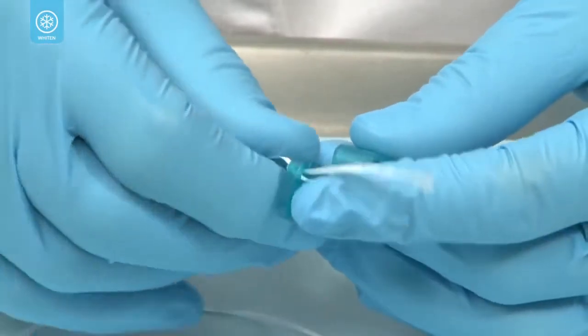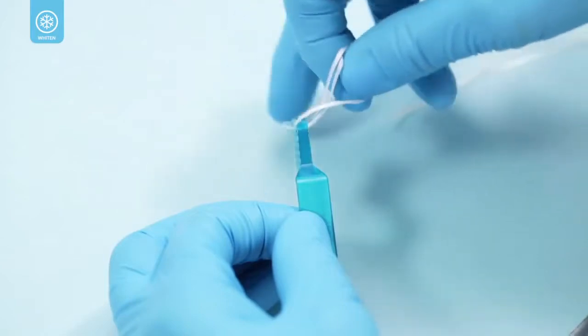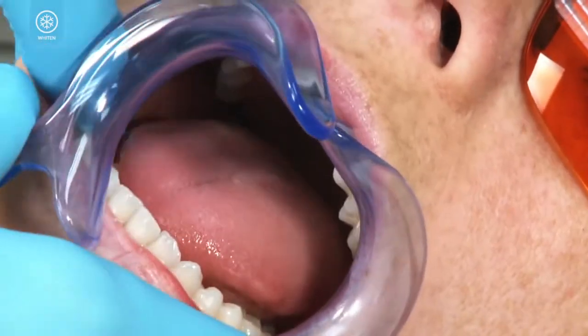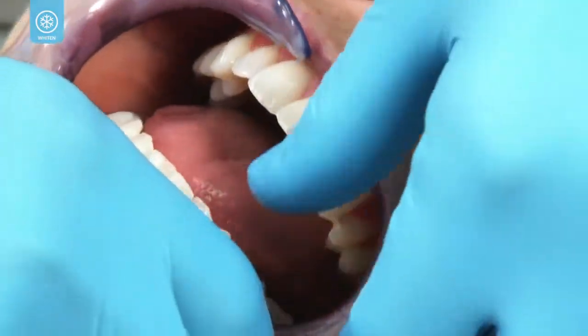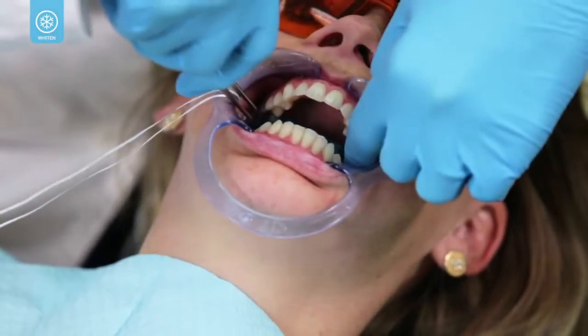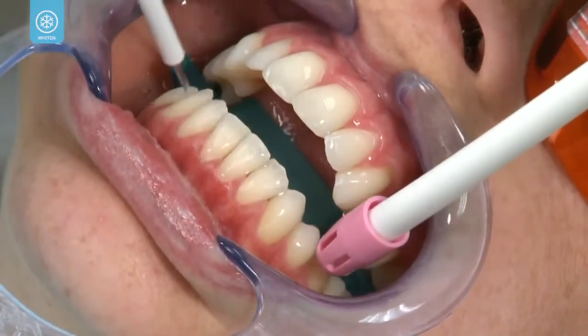For added security, tie a length of dental floss through one of the holes in the isoblock to prevent accidental swallowing. Place a self-supporting lip and cheek retractor followed by the Ultradent isoblock. Instruct the patient to hold the isoblock in place with gentle but firm biting pressure. Completely rinse and air dry the teeth.